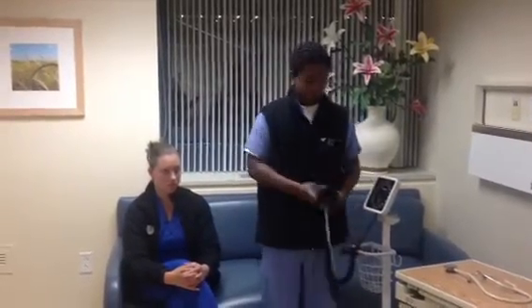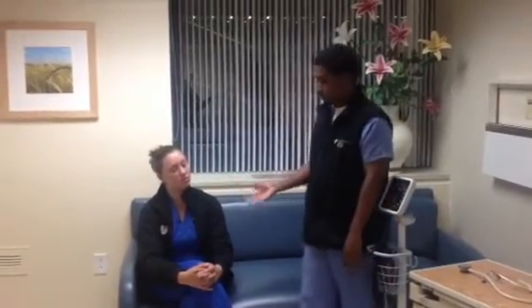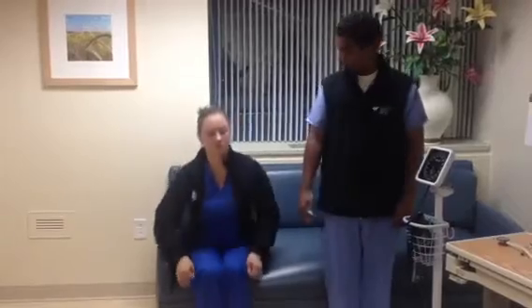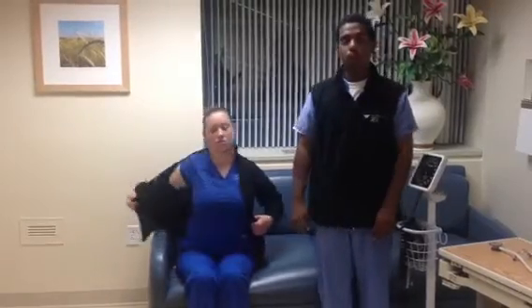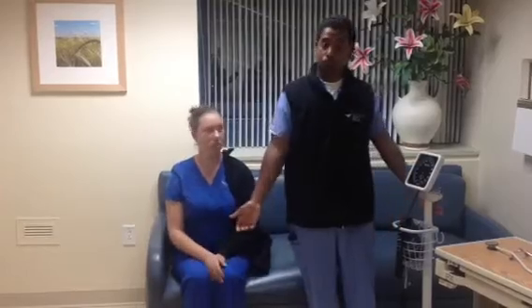Another factor when taking a manual blood pressure is the positioning of the patient. As the patient is sitting right now, this would not be a proper way of taking a blood pressure. I would ask the patient to please uncross her legs to the floor and put both arms to the side. Also, clothing will be a factor in taking the blood pressure, so I would have her remove the sleeve from her right or left arm, depending on any precautions.